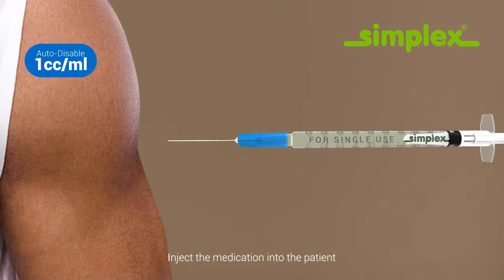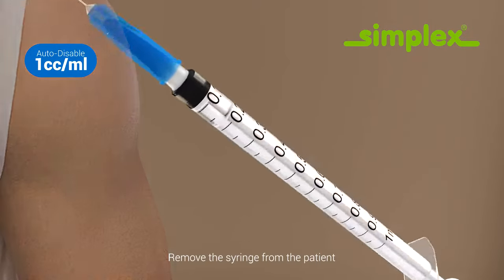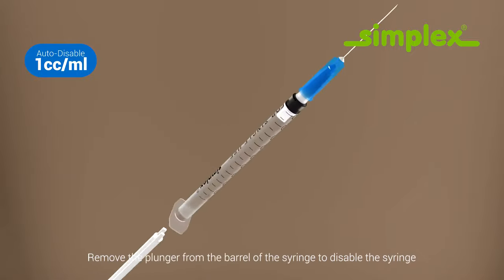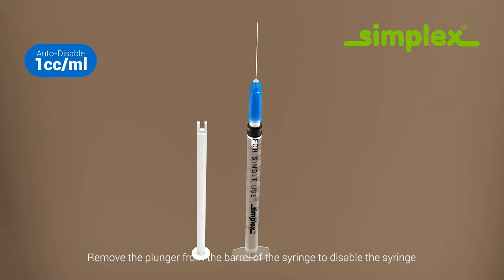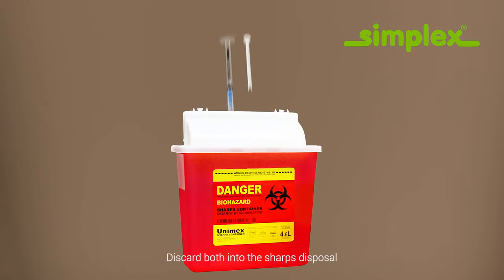Inject the medication into the patient. Remove the syringe from the patient. Remove the plunger from the barrel of the syringe to disable the syringe. Discard both into the sharps disposal.